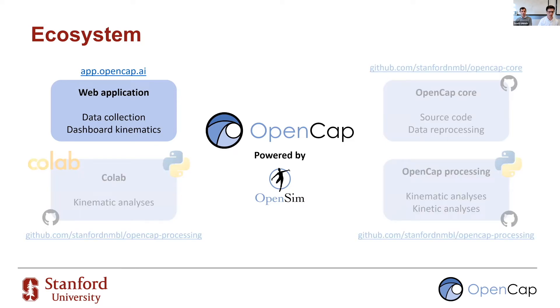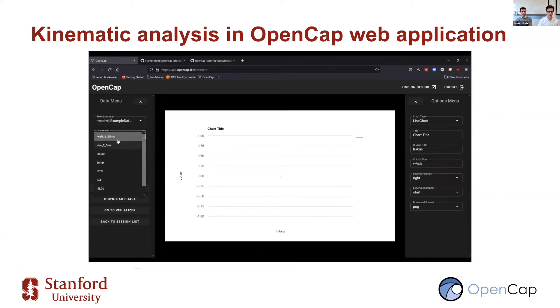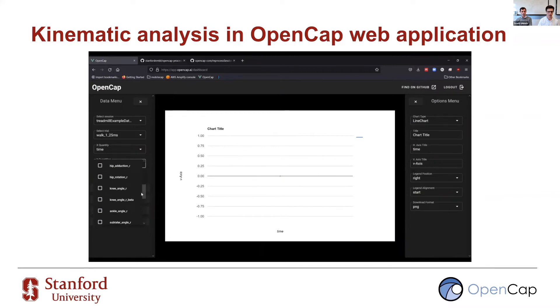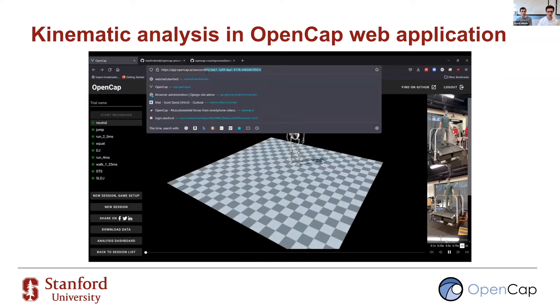To analyze data in the web application, say you've collected a treadmill walking trial and want to plot the knee angle. Click the Analysis Dashboard button, select the trial, set the x-axis to time and y-axis to knee angle, click Generate Plot, and you can zoom in to see gait cycles. An important concept is the session identifier — a long randomly generated string used to identify the data collection session. We recommend writing this down alongside other participant identifiers, as you'll use it to interact with our database.